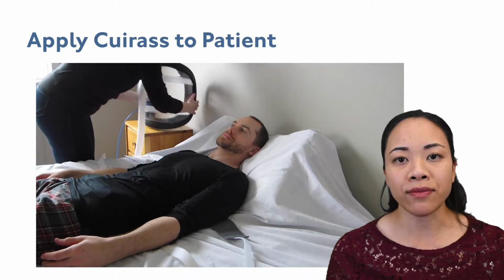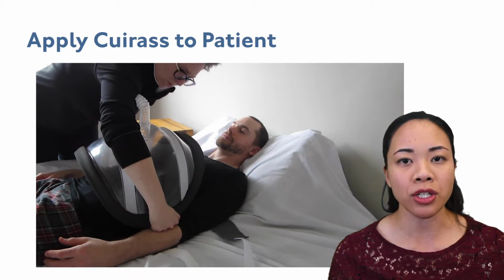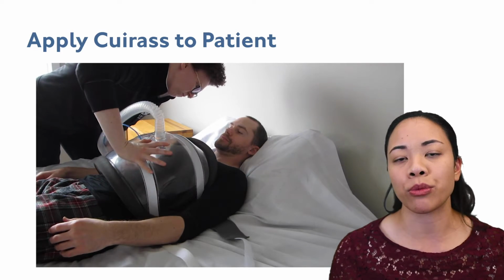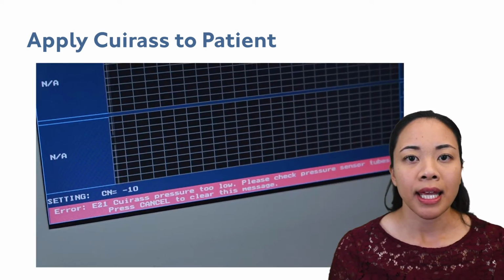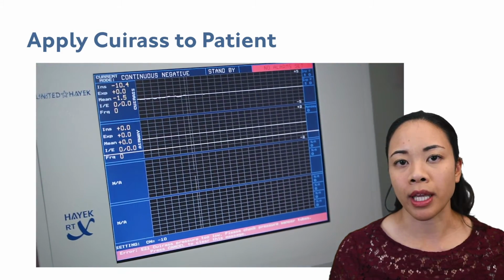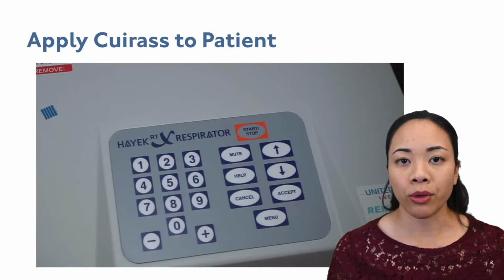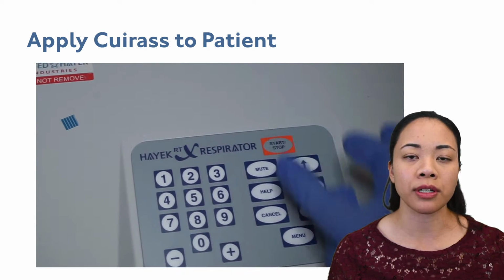Once all of the safety checks are done, pull the sides of the Cuirass open and place over the patient's chest and abdomen. Flex and advance downward on the chest until contact with sternum and abdomen is achieved. If there is a space between the foam seal and the patient's chest, the Cuirass shell will not be able to pressurize properly, and an Error 21 or low pressure alarm will occur. When ready to start therapy, press Start, Stop to begin pressure delivery.